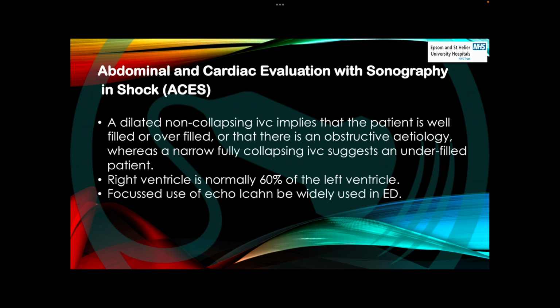Right ventricle is normally 60% of the left ventricle. So we have to keep this in mind. If there is any increase in the right ventricle, it will be noticeable, so we will be able to find out by using the probe whether the right ventricle is enlarged. There is enlargement in the right ventricle as a result of any obstructive shock.